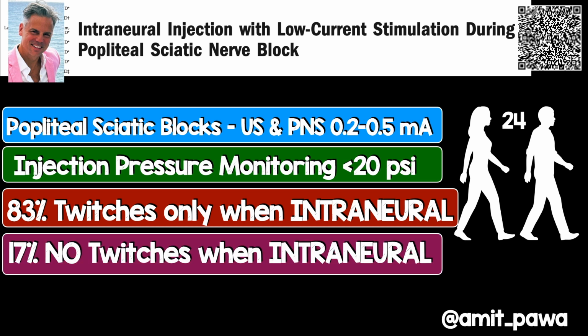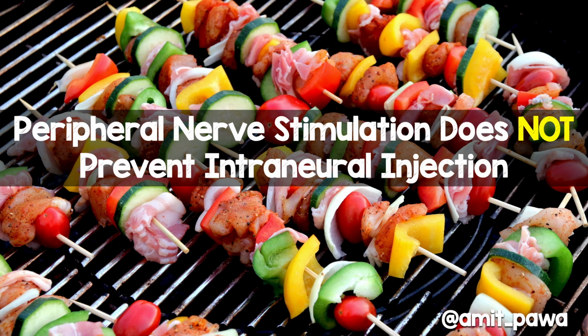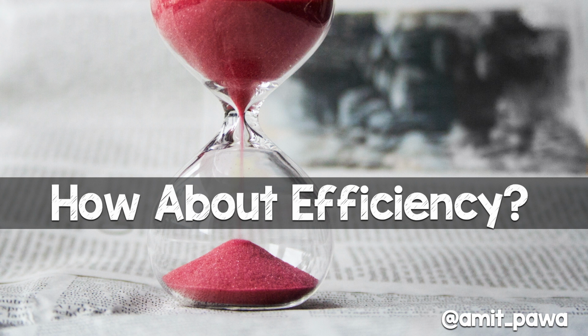And in 17% of cases, there were no twitches when the needle was intraneural. So hold on a minute, peripheral nerve stimulation did not prevent intraneural injection as visualized on ultrasound. So I think we can say that if you want to prevent kebabbing nerves, peripheral nerve stimulation does not prevent intraneural injection.